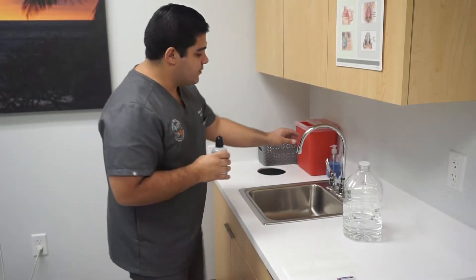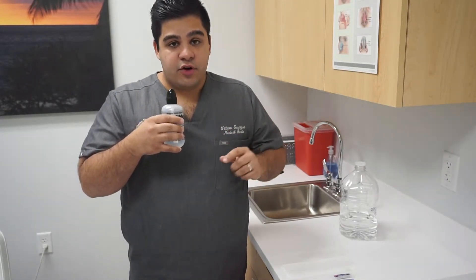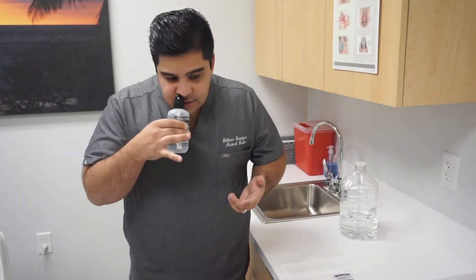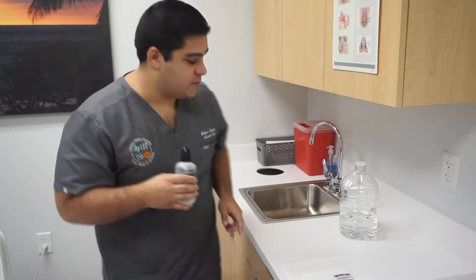I am going to demonstrate right now how to rinse. An important thing: when you are going to squeeze the bottle, you want to take a deep breath in and then softly exhale through your nose as you squeeze the bottle. That way the water doesn't get in the back of your throat or in your eustachian tubes.